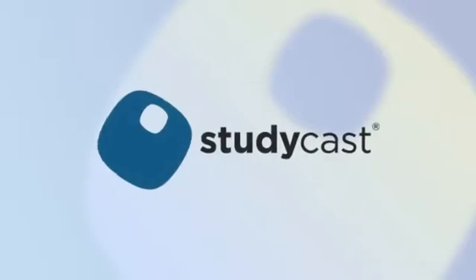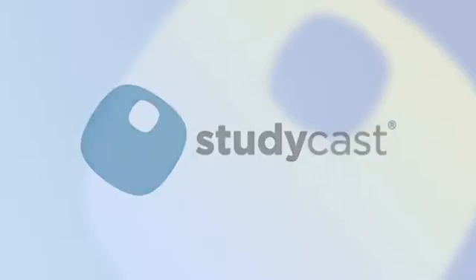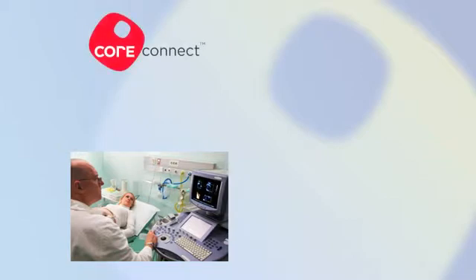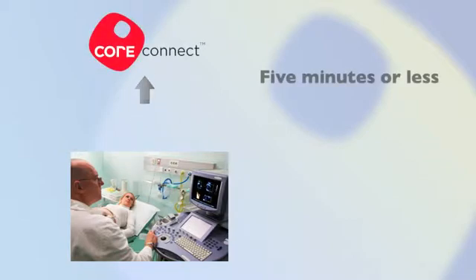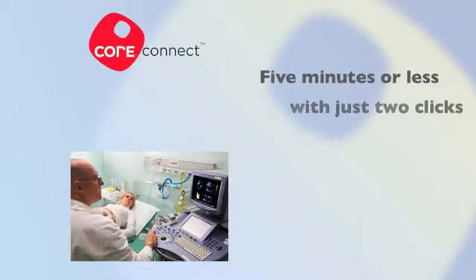This solution is called StudyCast. The StudyCast process begins with the sonographer. Using our easy uploading tool called CoreConnect, the sonographer sends out a study in 5 minutes or less with just 2 clicks.